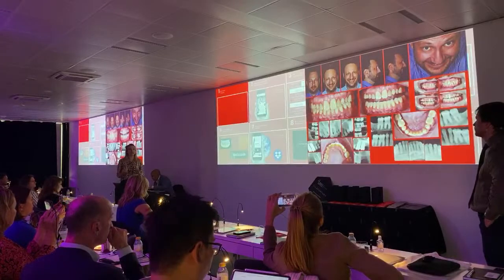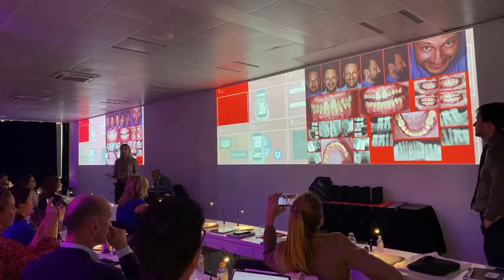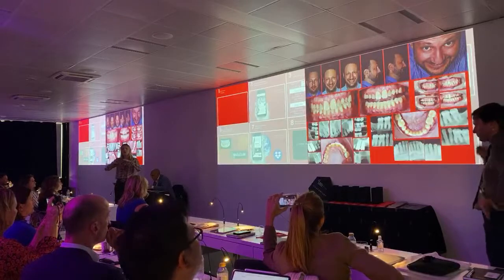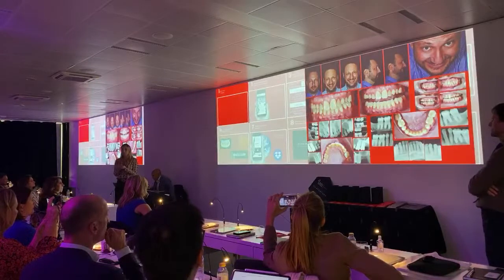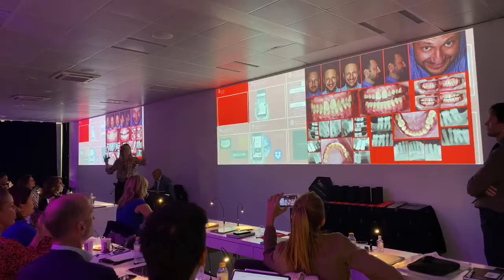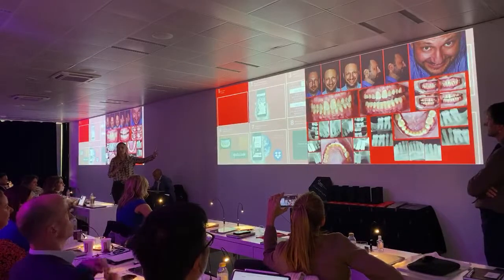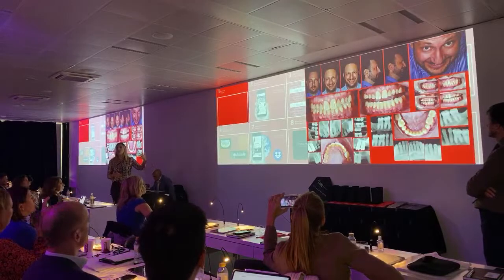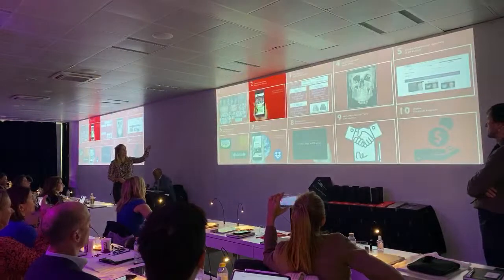Sometimes I didn't do the first appointment, it was Robert, or you have another dentist that does the first appointment, but you are the clinical coordinator. You are the one that will control what's going to happen with all the cases. So you need to give a direction. So I designed a very fast organization of these photos, so I can see, and in 5 minutes or less, I already know what I need to tell my DSD coordinator she needs to do. So this is the first thing that she does. She organizes, and then she sends it to me.